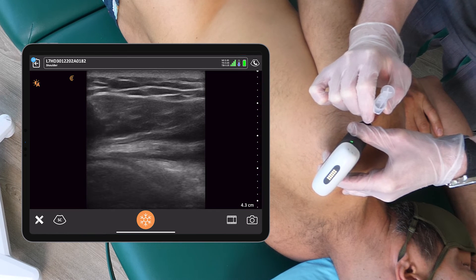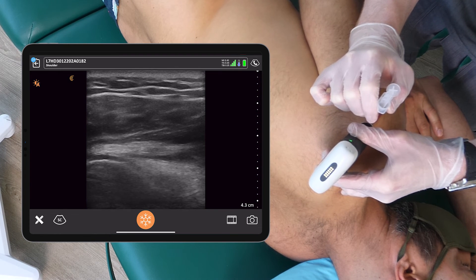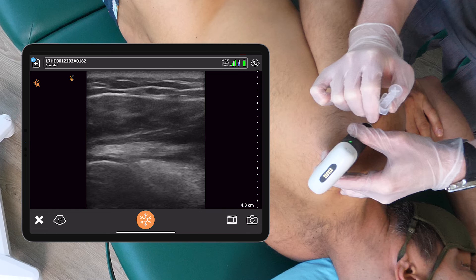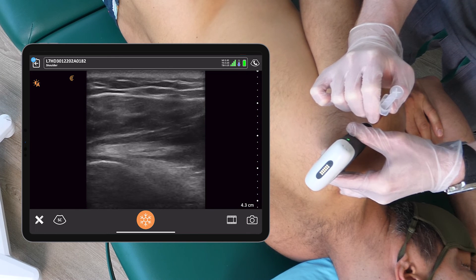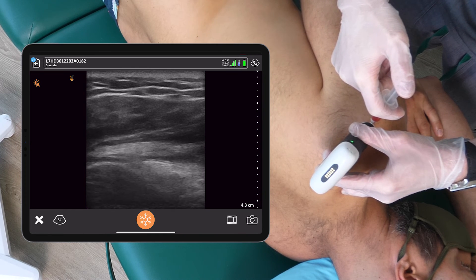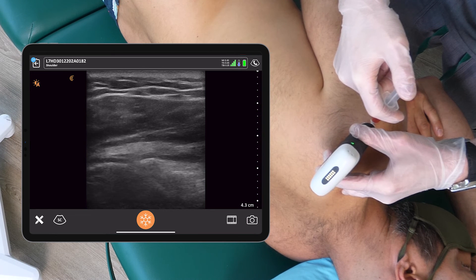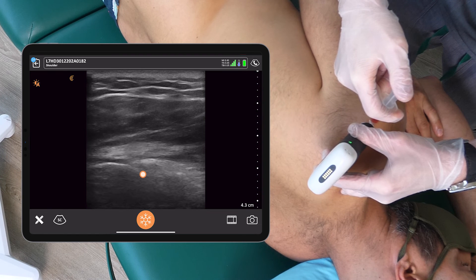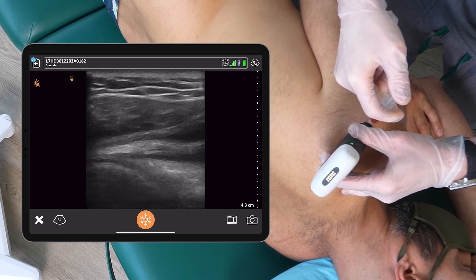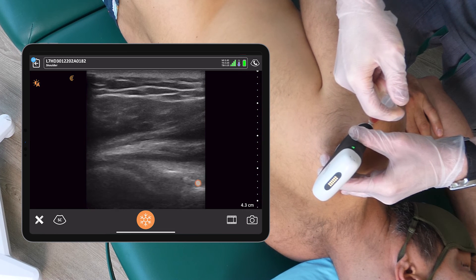We're just going through a little bit of tissue here. So we missed the labral tissue there, and we're going to see if we see any distension. If we don't, we can determine that that is in the capsule — so a little bit of distension. That is a perfect injection. No problems. We can even see that fluid going in, and we haven't disturbed the labrum.